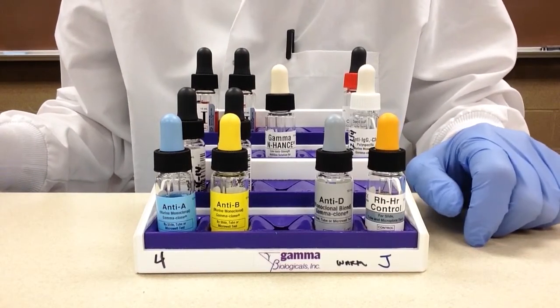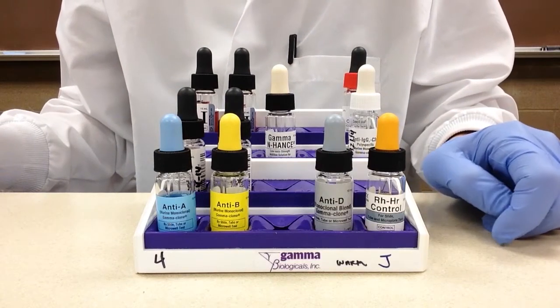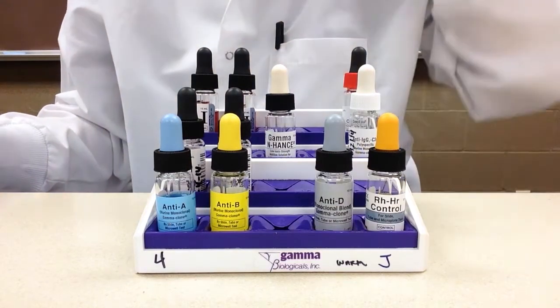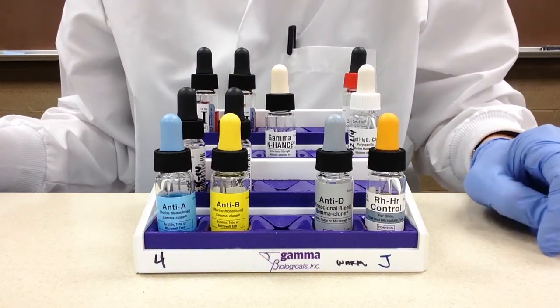In this video we are going to look at a reagent rack for blood bank tube testing. Before I go into what all these different reagents are, I just want to lay down a few ground rules that we adhere to in this laboratory.